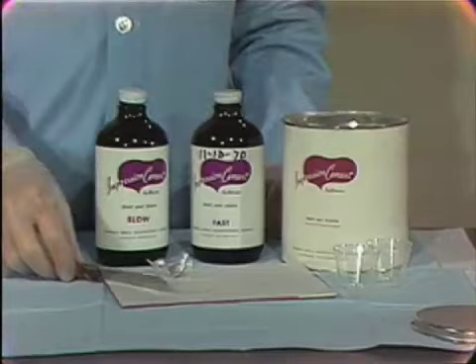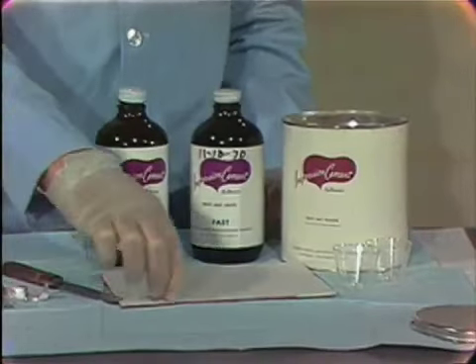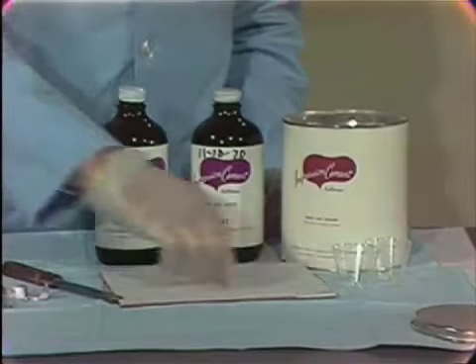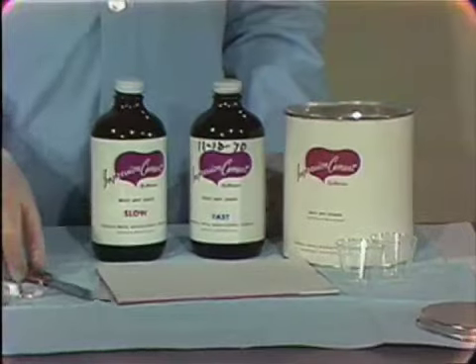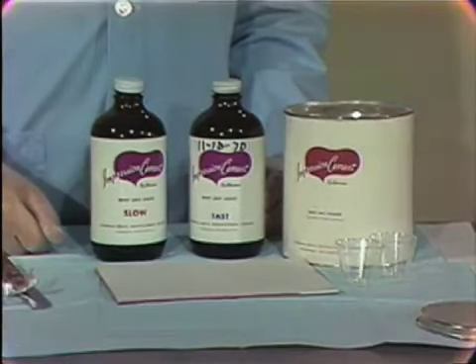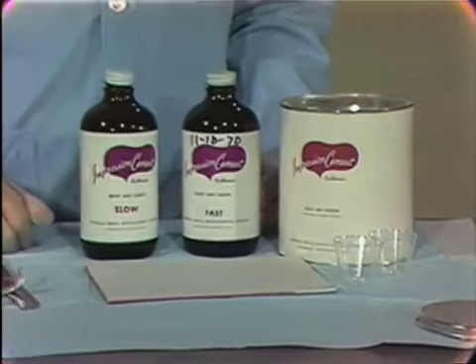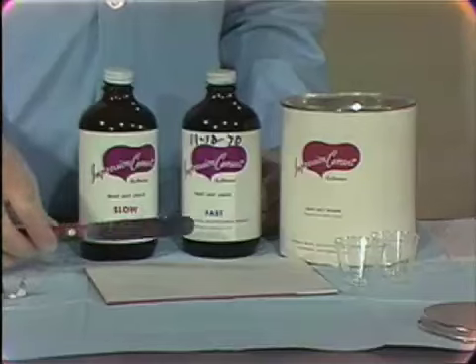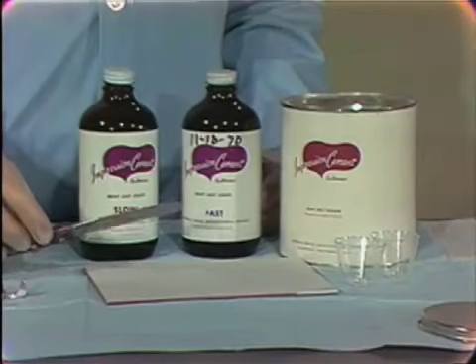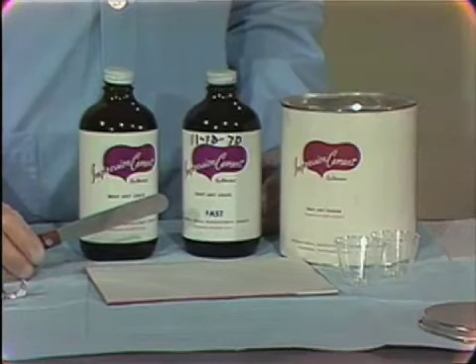Now, the mixing of the material should be done on a parchment pad. Zinc oxide and eugenol liquid, or eugenol liquid, will soak into a regular pad, so you have a parchment pad. Have a pad sufficiently large to accommodate the amount of mix that we would need. You need a wide spatula. The fine mesh powder makes it difficult to incorporate the powder into the liquid.